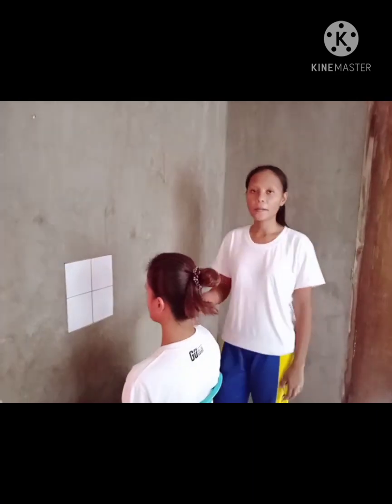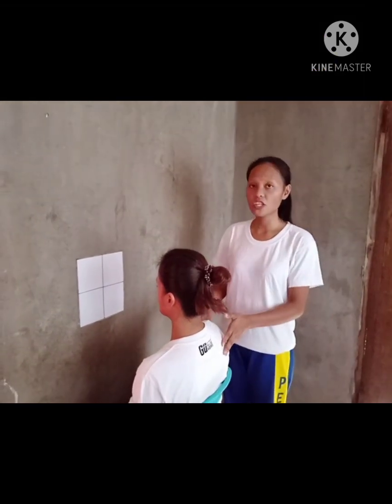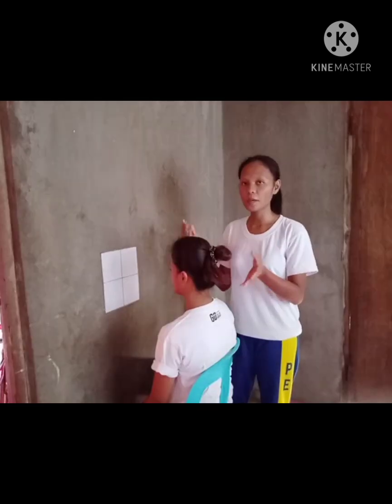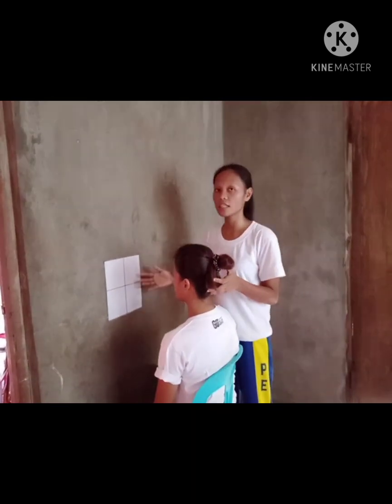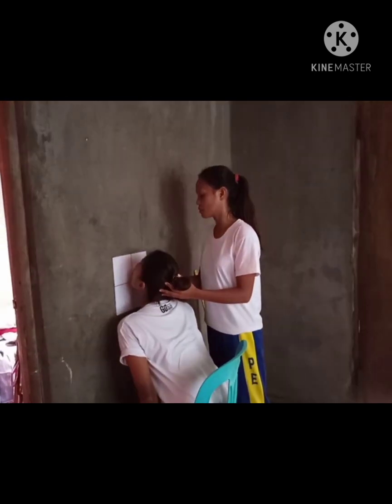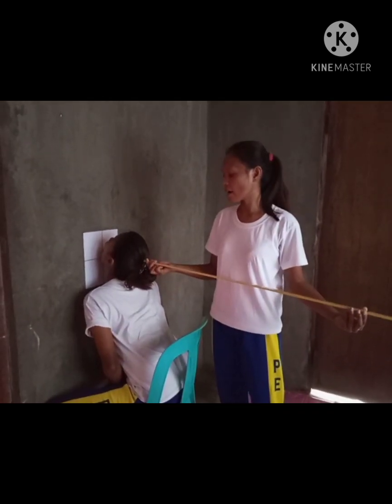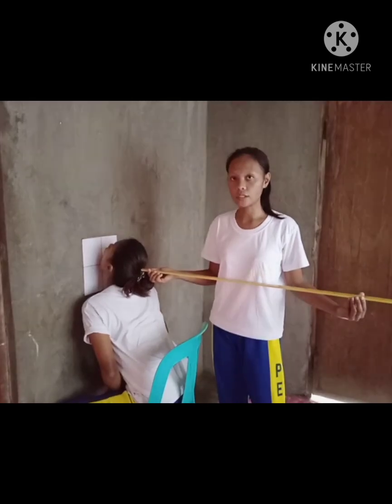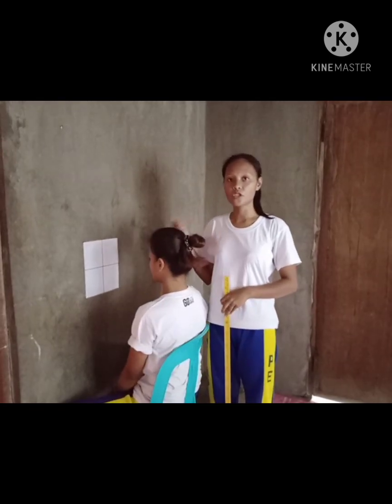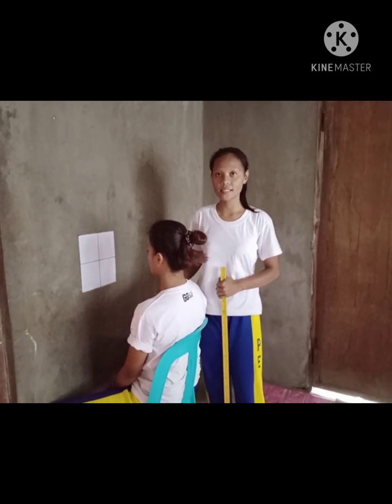We have the parieto-acanthial projection, open mouth Waters. The patient is seated upright, and we ask the patient to hyperextend the neck toward the IR. Ma'am, extend. Open mouth. The central ray must be horizontal to the IR and exit at the acanthion. This shows the sphenoid sinuses projected through the open mouth along with the maxillary sinuses.